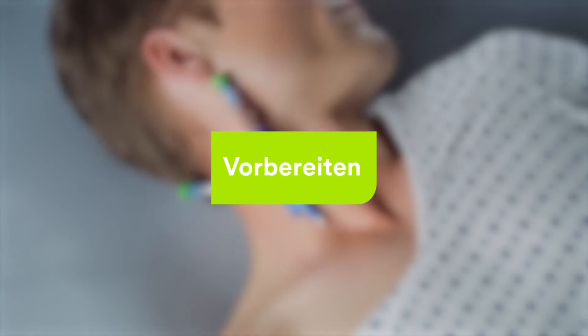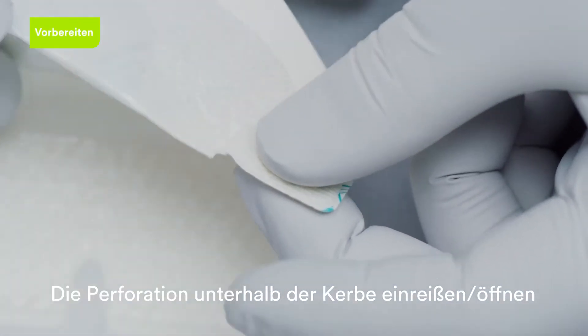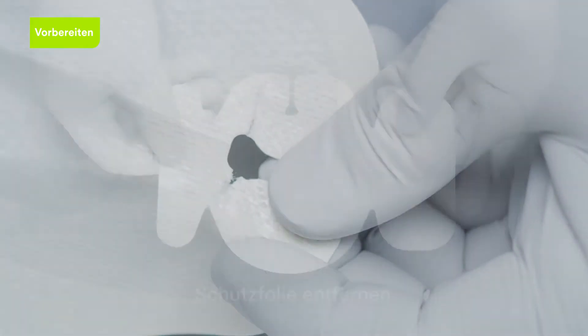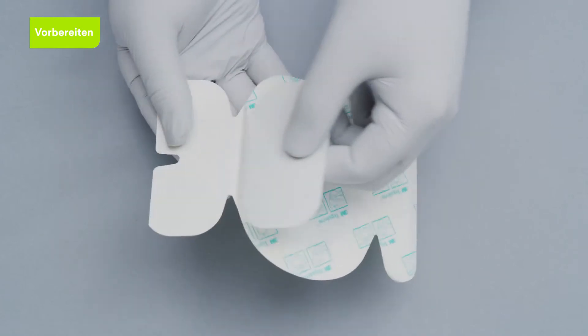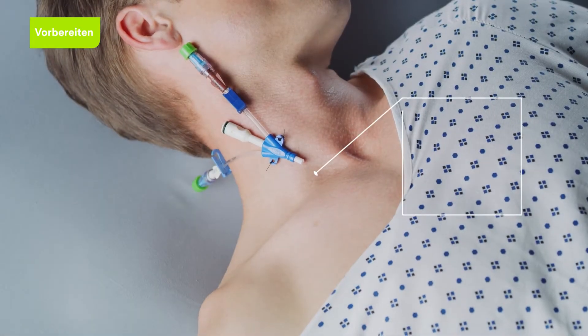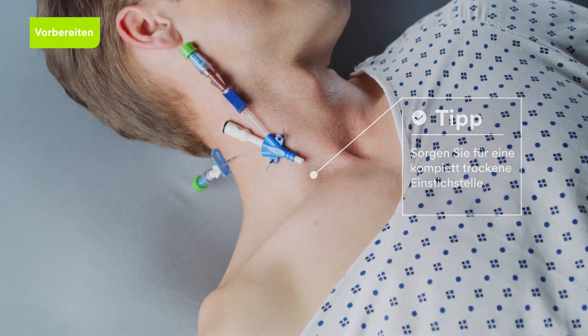Prepare the site according to facility protocol. Open perforations in the keyhole notch before removing the dressing liner. Peel the liner from the dressing and place on a sterile field prior to insertion. Ensure the catheter insertion site is completely dry for optimal adhesion and to prevent skin irritation.